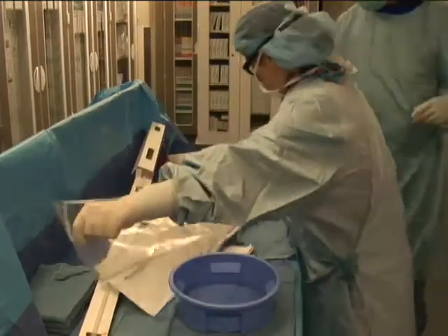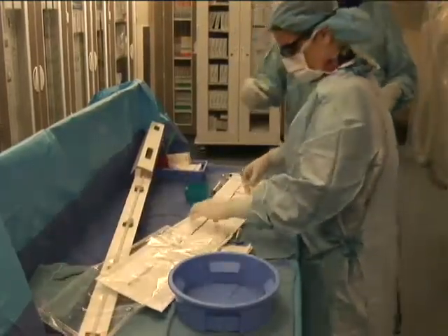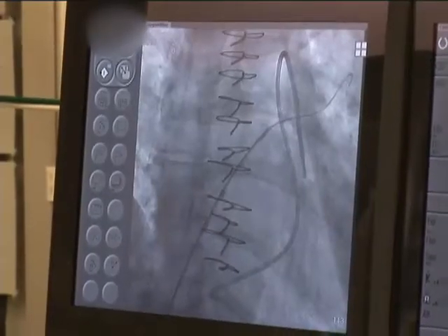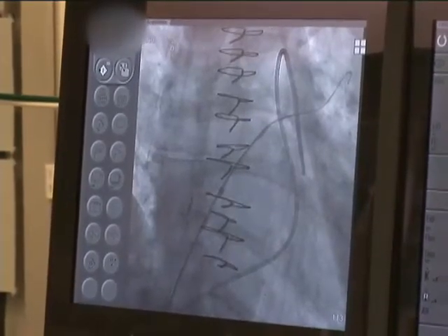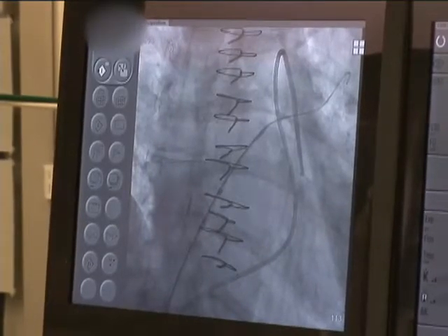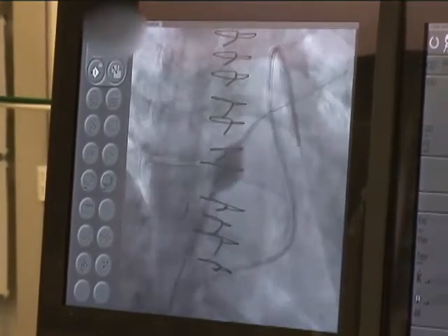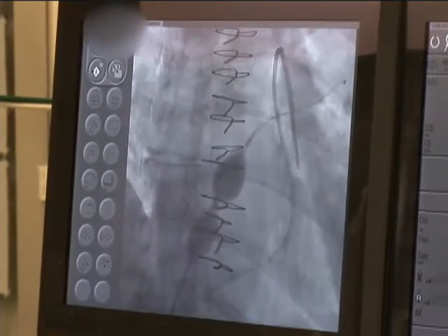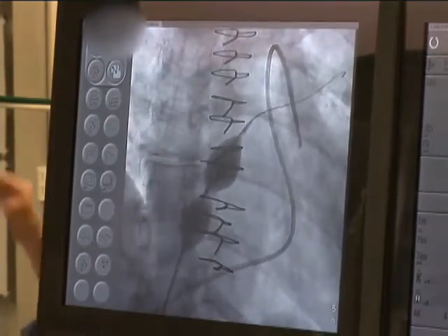A balloon catheter is opened, flushed, and inserted into the left atrium. Under fluoroscopy, the balloon catheter is advanced across the interatrial septum. The balloon is slowly inflated with a contrast solution and visualized on fluoroscopy. A clear-cut waist is seen in the balloon due to the atrial septum.